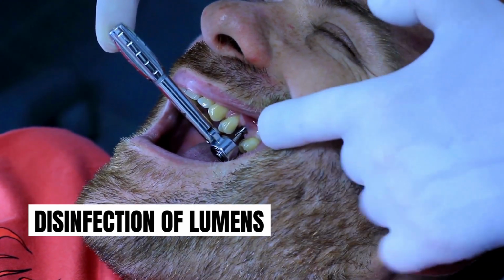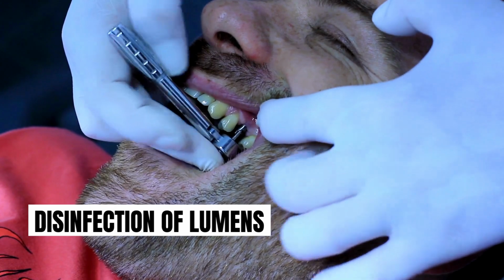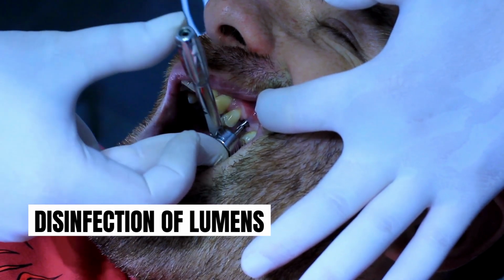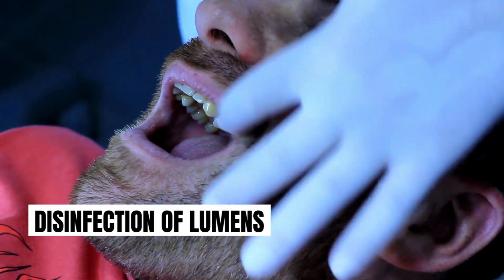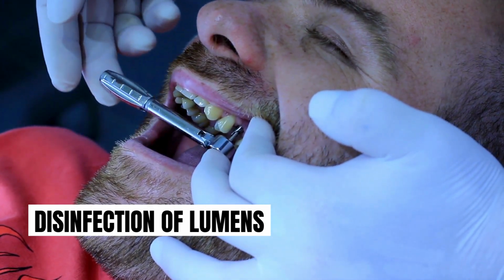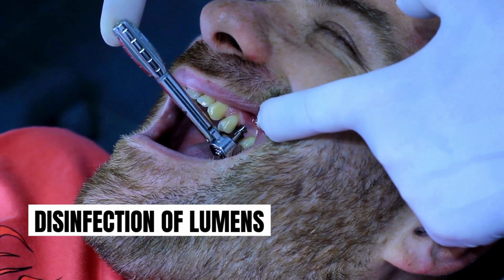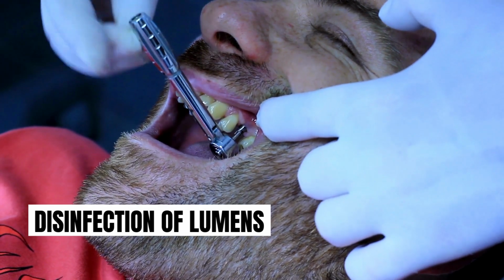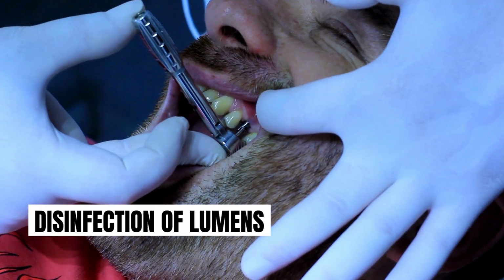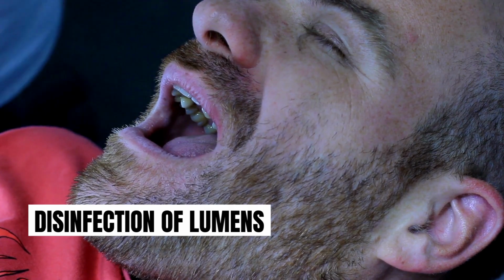Since the dental handpiece consists of lumen and fissures, they retain the infective material from the patient, and this makes it very inconvenient to clean and disinfect. The spores existing inside the lumen may survive autoclaving unless it is treated on its interior surface with chemical disinfectants. Since these microorganisms are anchored to this equipment, they may not be readily detached on flushing, but may shed pathogens on high-speed operations. The lumen poses an additional potential site of internal contamination, which may lead to a high risk of cross-contamination unless it is sterilized in between the patients.